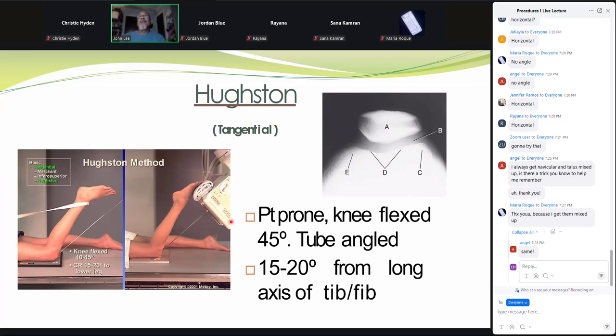You can use a sheet or a pillowcase or tape, however, patient can hold their ankle and then hold on to the other ends there, and that'll hold their leg there. Or if their leg is long enough, you could pad it so that it ends up resting on the collimator housing. So we get good separation of the femoral patellar joint space here, I'm sorry.